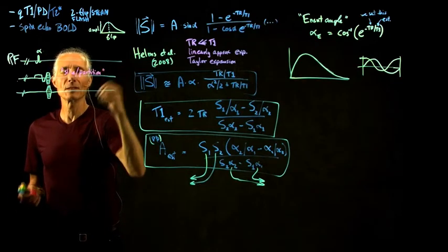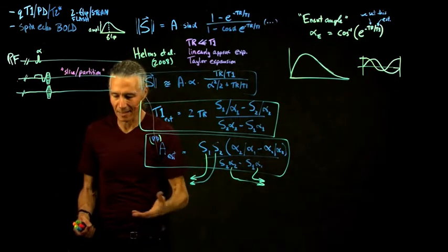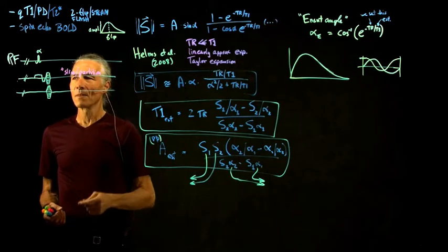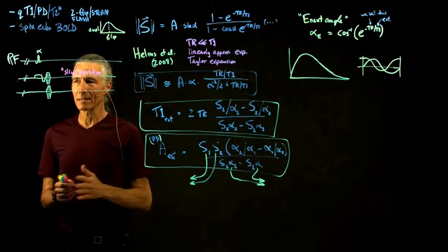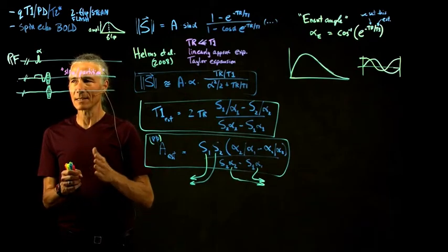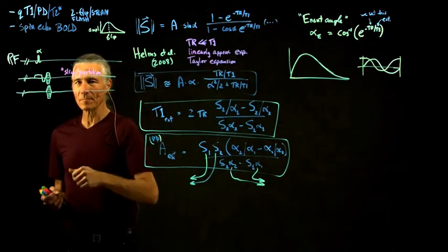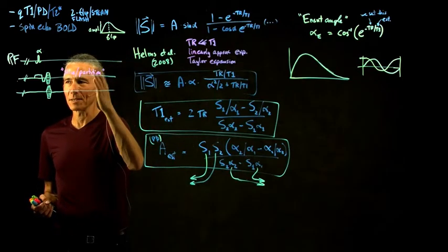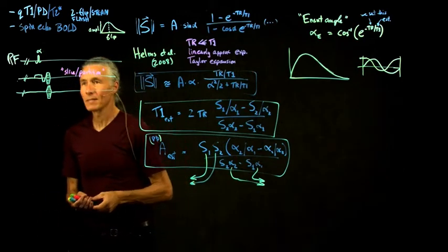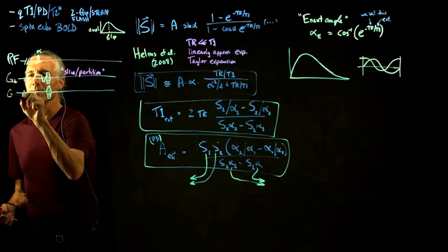The reason you call it partition is because it's a partition of k-space. It's not actually a slice. The scanner says slice when you say, I want 176 sagittal slices, but what you're really programming into the scanner is, I want 176 steps in k-space. So that's a partition. A partition is one step in z k-space. So here's the z gradient, and here's the y gradient.